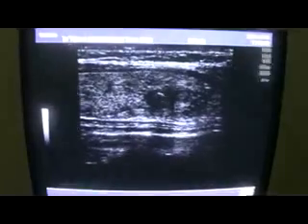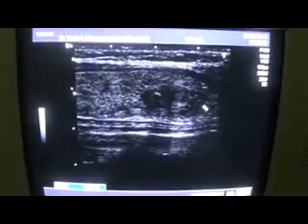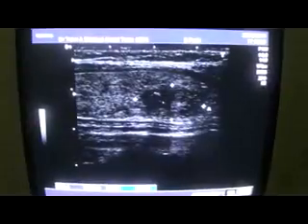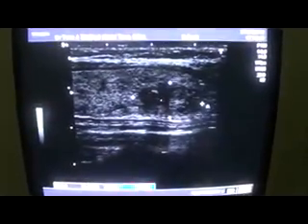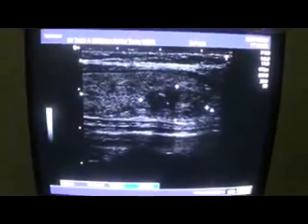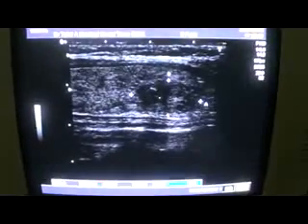Yeah, now this is a calcification within it. In total, it measures approximately 16.6 millimeter by 8.5 millimeter, and it's both cystic and in fact a solid mass with internal echogenic areas with internal cystic areas.